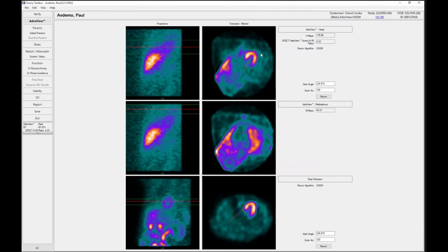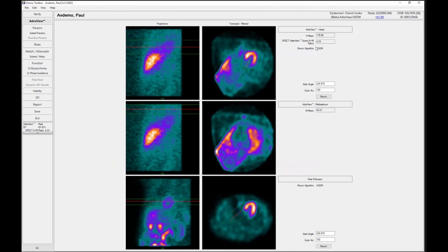And so based on the SPECT study, we get the heart-to-mediastinum ratio of 4.23 for this particular patient, which is very high and very normal. It starts to get abnormal around the 2.5 or less range, and so you can see for this particular patient, it's very normal.